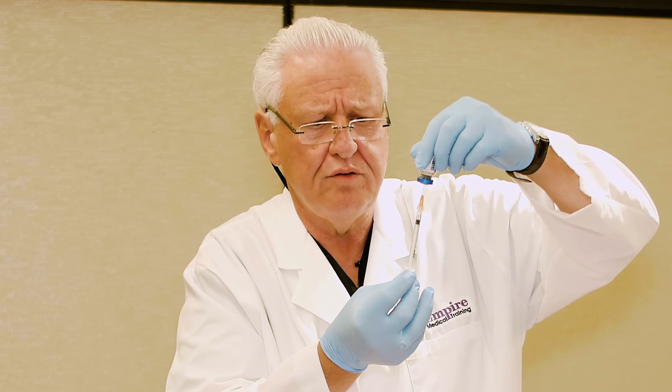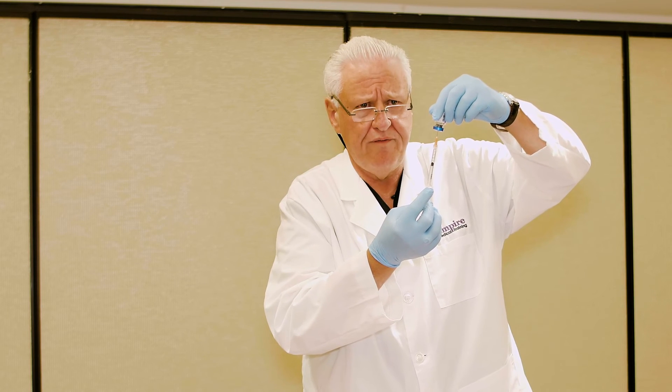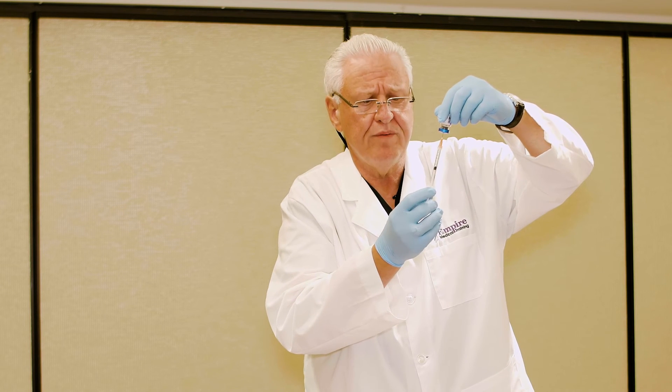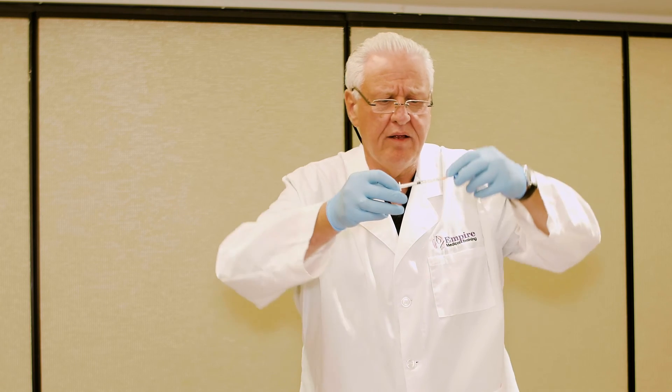At this dilution ratio of 2.5 ml, each tenth of an ml will be 4 units of toxin. To inject 24 units — which is what our first treatment is going to be — we need 0.6 ml of volume.